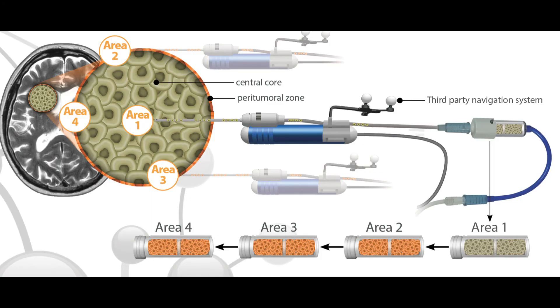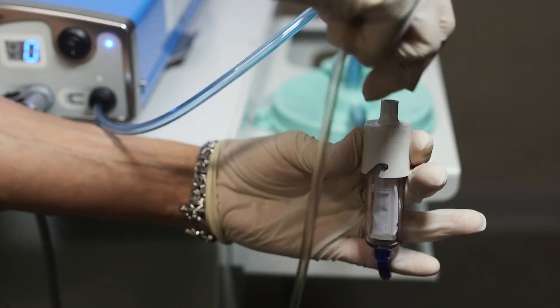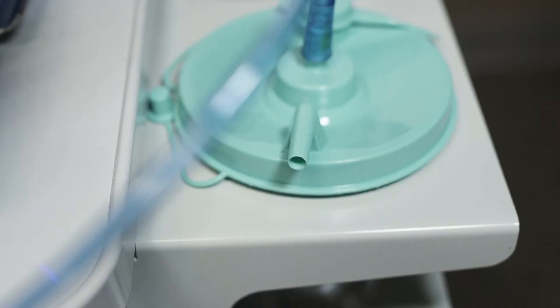If you will be collecting tissue removed during the procedure, a specimen collector will be placed between the end of the handpiece and the canister.